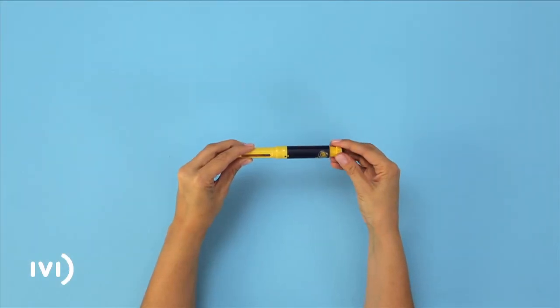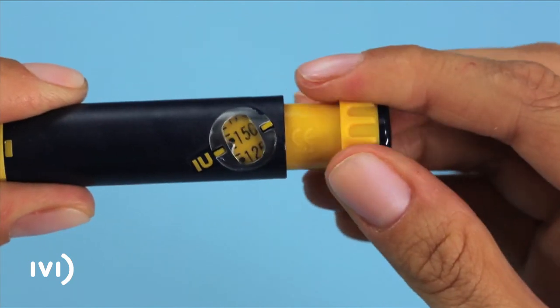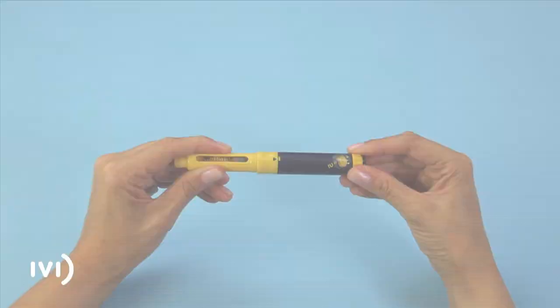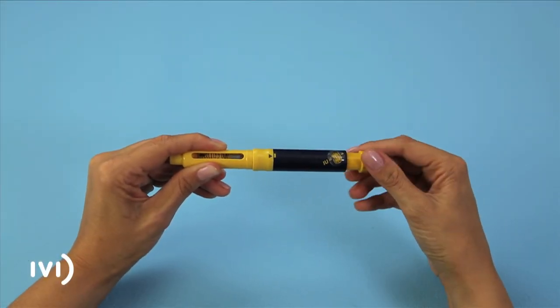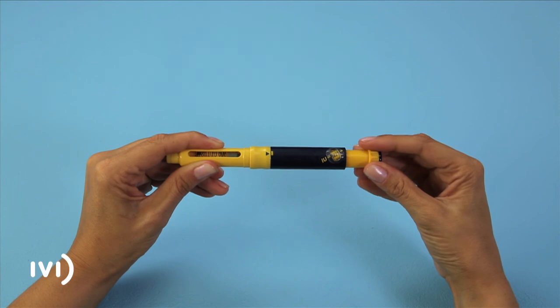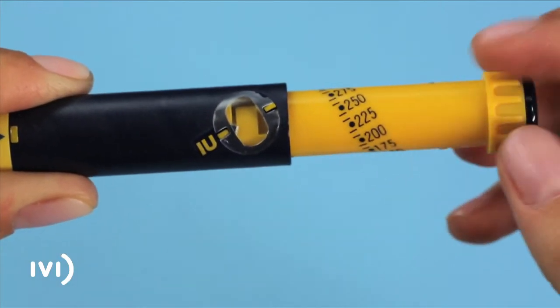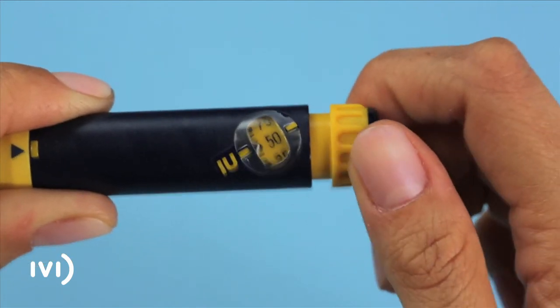Turn the dosage dial until the display shows the amount prescribed by your doctor. If you accidentally turn the dial too far, do not try to turn it back. Keep turning the dial as far as it will go and then push the button until the display once again reads zero.